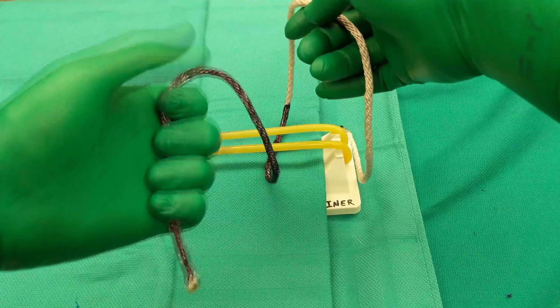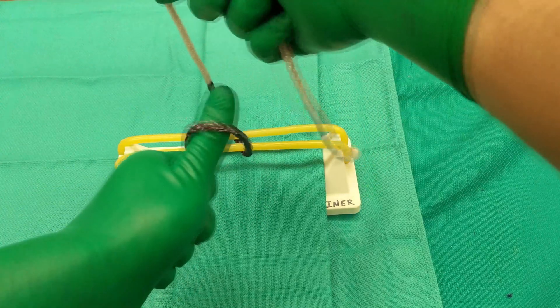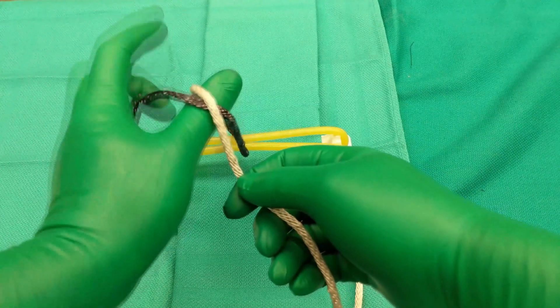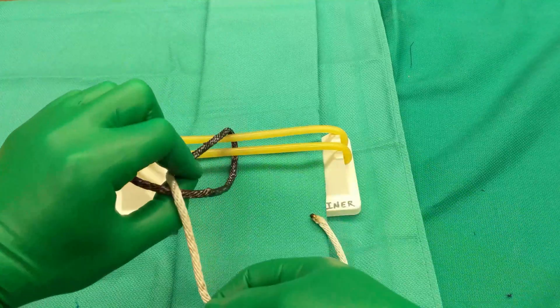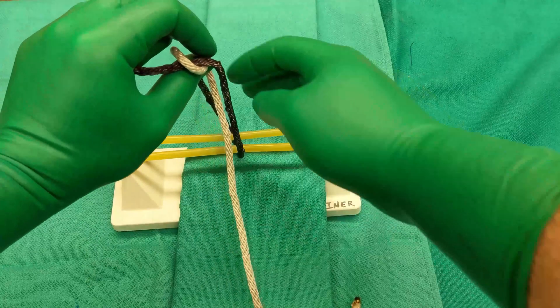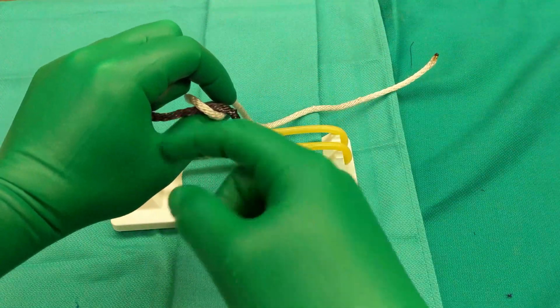Control the strand with a finger grip, then roll your wrist forward and sweep the strand on top of your thumb. Your right hand then brings the opposite strand across and makes an X on the back of your thumb. Bring your index finger up and over the opposite strand and make an OK sign. Roll your wrist forward, then pinch the opposite strand between your thumb and index finger. Rotate your wrist back and pull the strand through the loop. Now switch directions of your hands to tighten the knot.